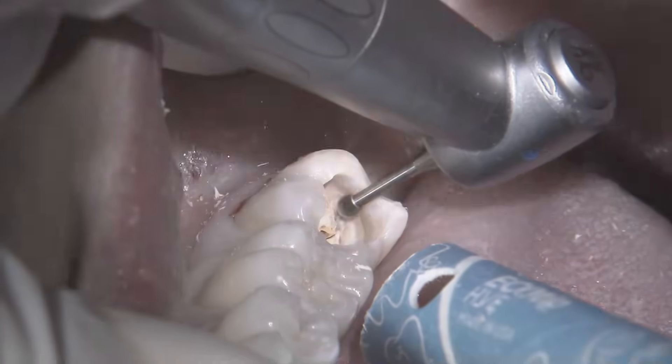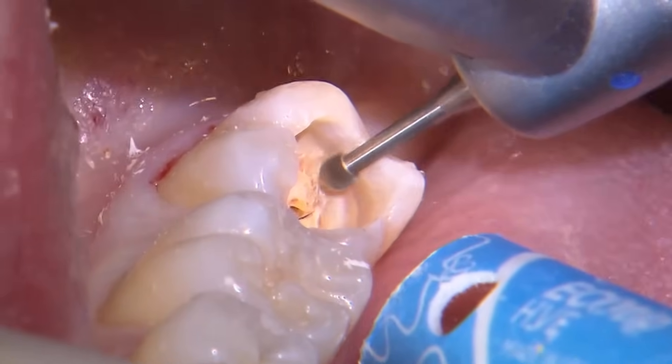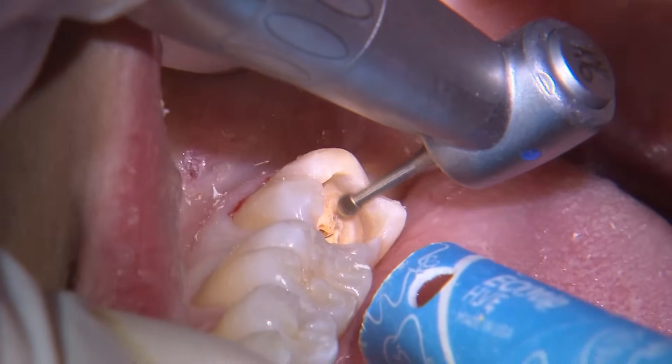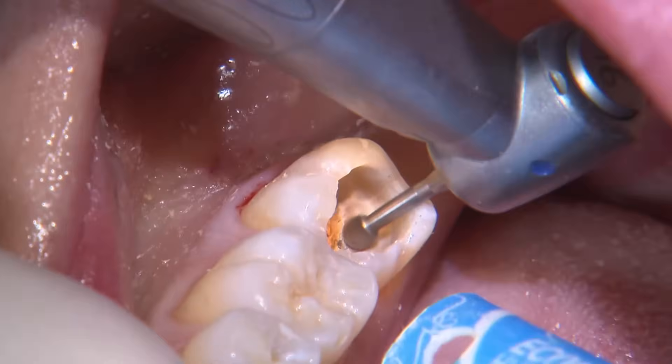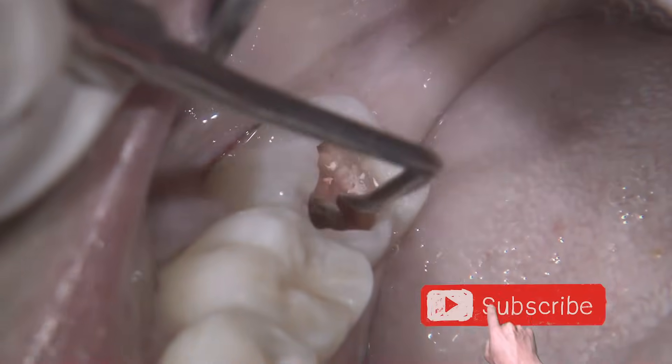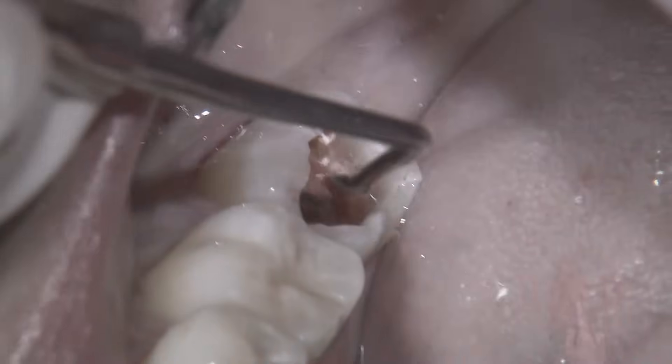Once a clean DEJ ring around the prep is achieved, I complete the rest of the caries removal with a slow speed round burr along the axial walls while with light pressure carefully advancing apically. I like to use caries indicator dye as an aid to help guide where demineralized tooth structure is, but keep in mind there may also be false positives.